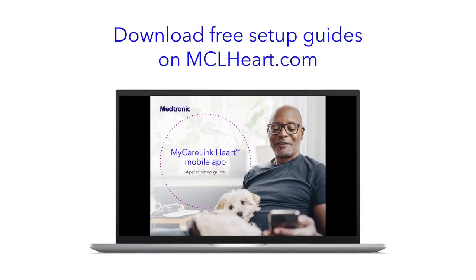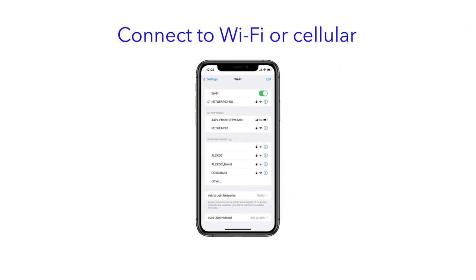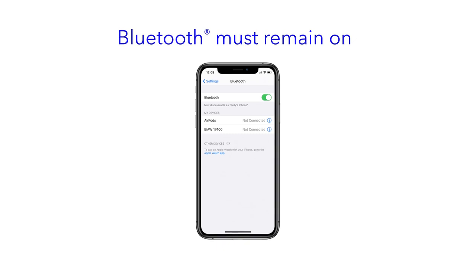You can download free setup guides on mclheart.com. You will also need to make sure that your smartphone or tablet has a Wi-Fi or cellular connection. Finally, please ensure that your smartphone or tablet has Bluetooth turned on. Bluetooth must always remain on for the MyCareLink heart mobile app to securely send your heart device data to your clinic.